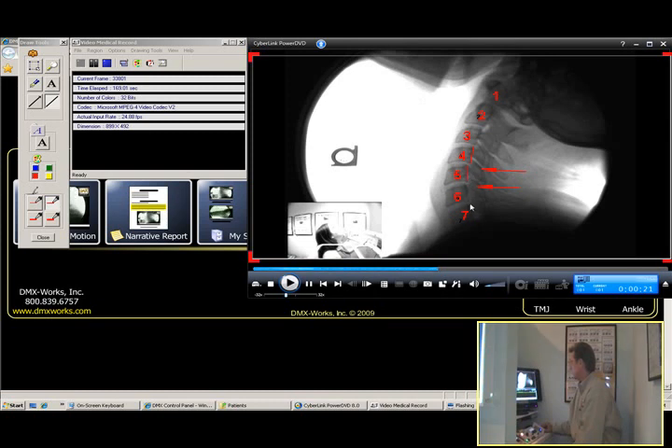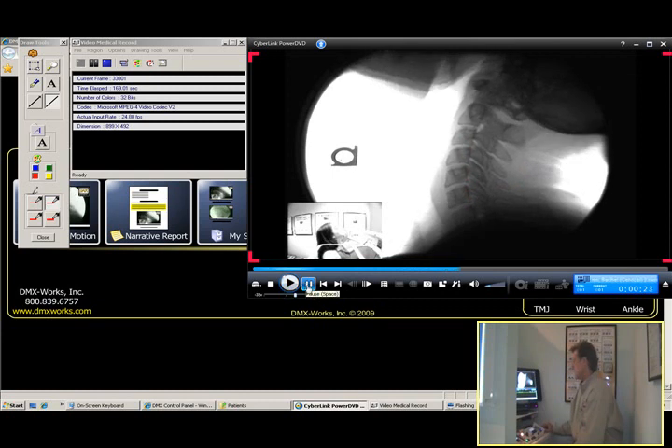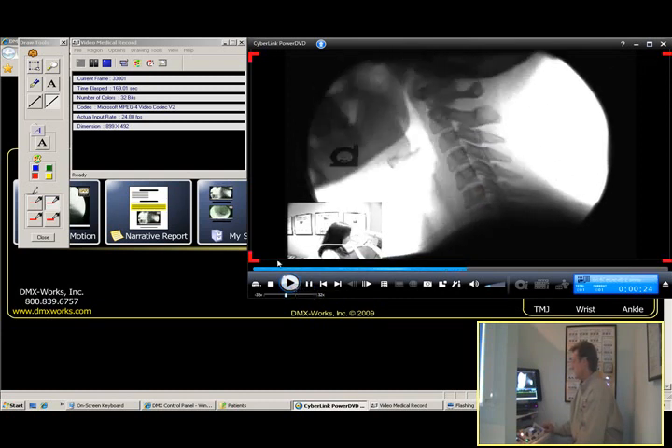So that's where the vertebrae have slid back. I'm going to draw George's line real quick and easy — takes a steady hand. And here we can see where C4 has moved backwards on C5, and C5 has moved backwards on C6. We can go ahead and hit play and she'll bring her head back into a neutral position. That completes the video.